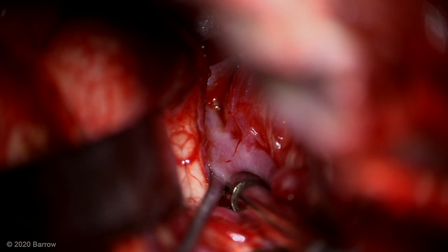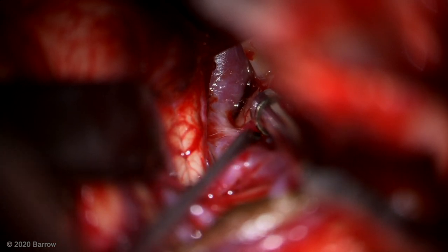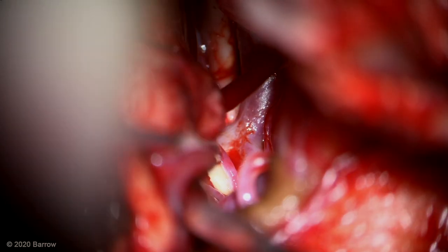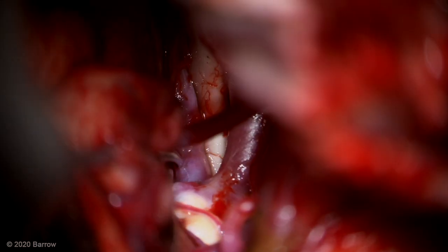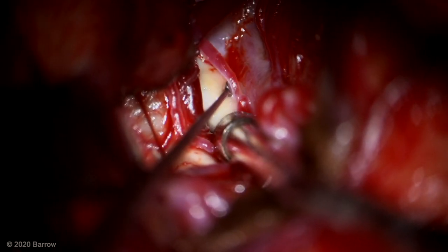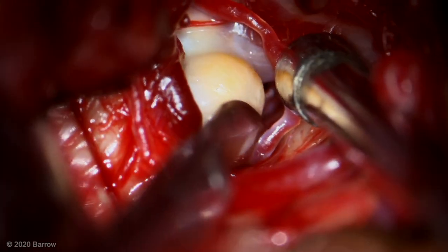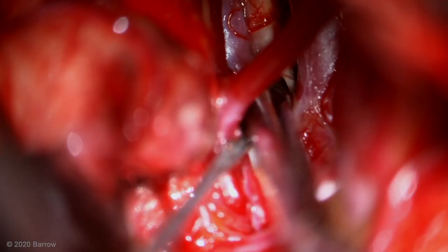The M1 segment is followed medially to arrive at the neck of the aneurysm. You can see the preservation of these bridging sylvian veins. What we find here is that the recurrent artery of Hubner, which is quite substantial in size, is densely adherent to the fundus of the aneurysm. This next sequence is the gentle breaking up of these adhesions and the freeing of the recurrent artery off of the aneurysm, enabling cleaner access for the clip to be applied across the neck.